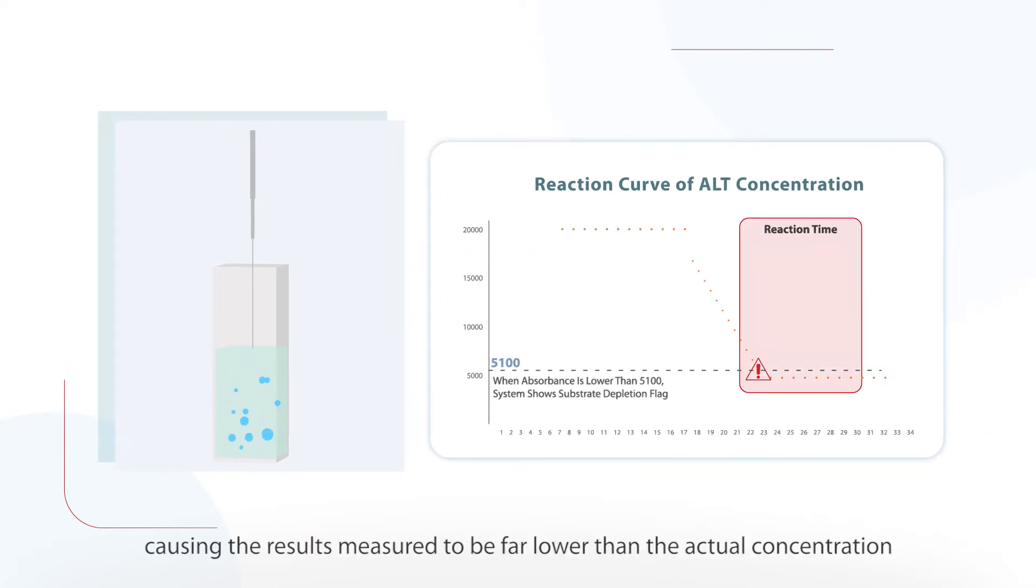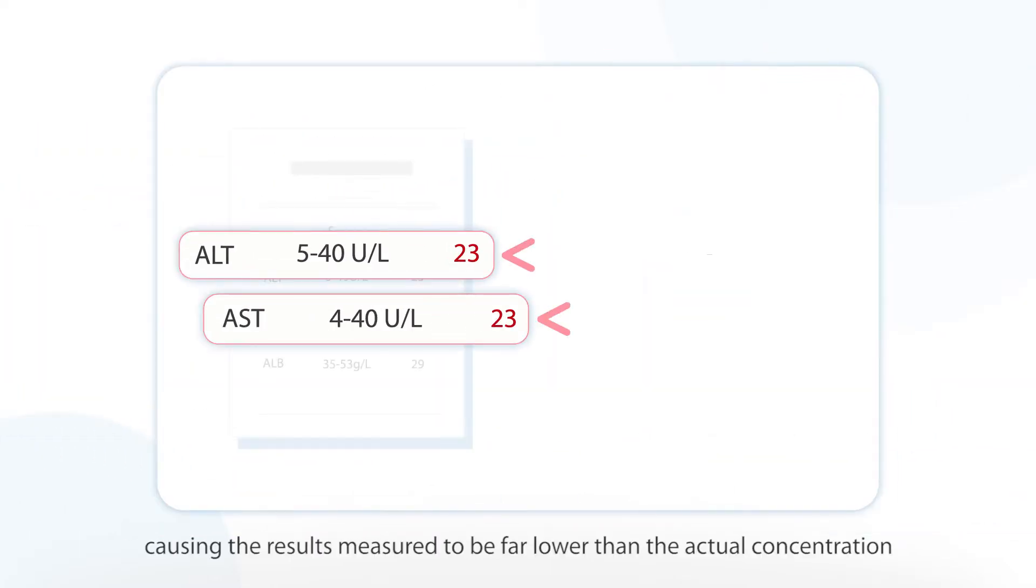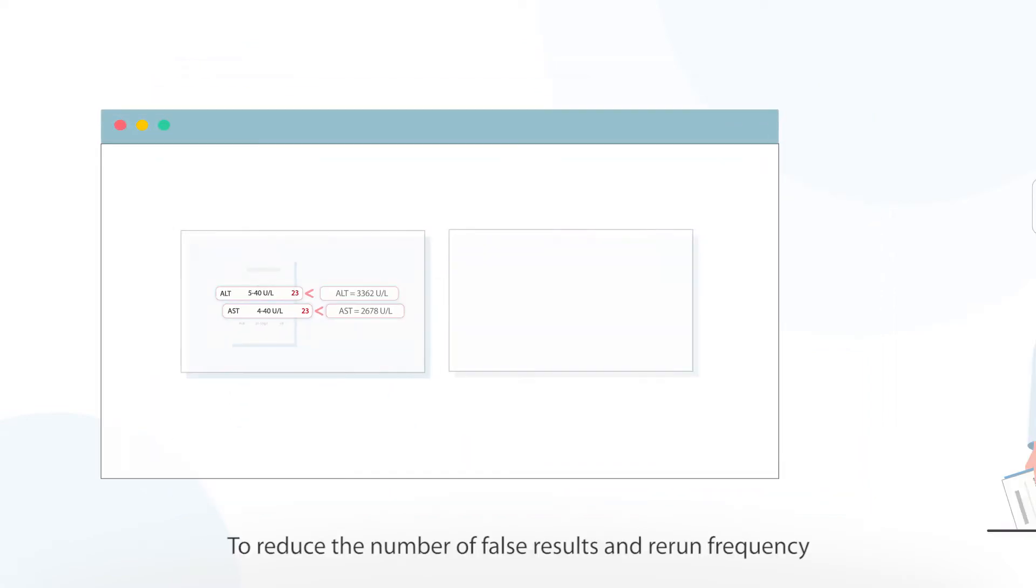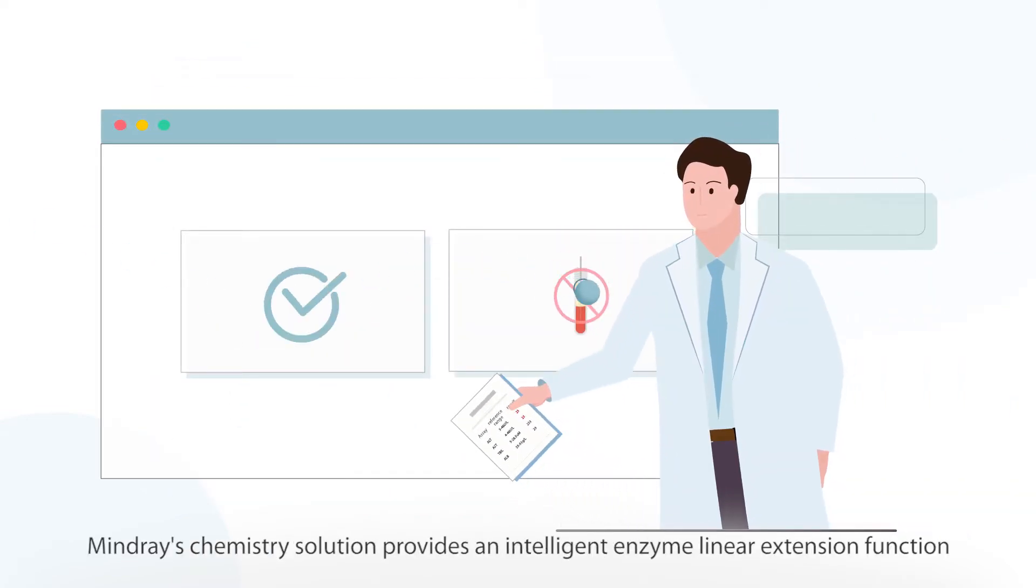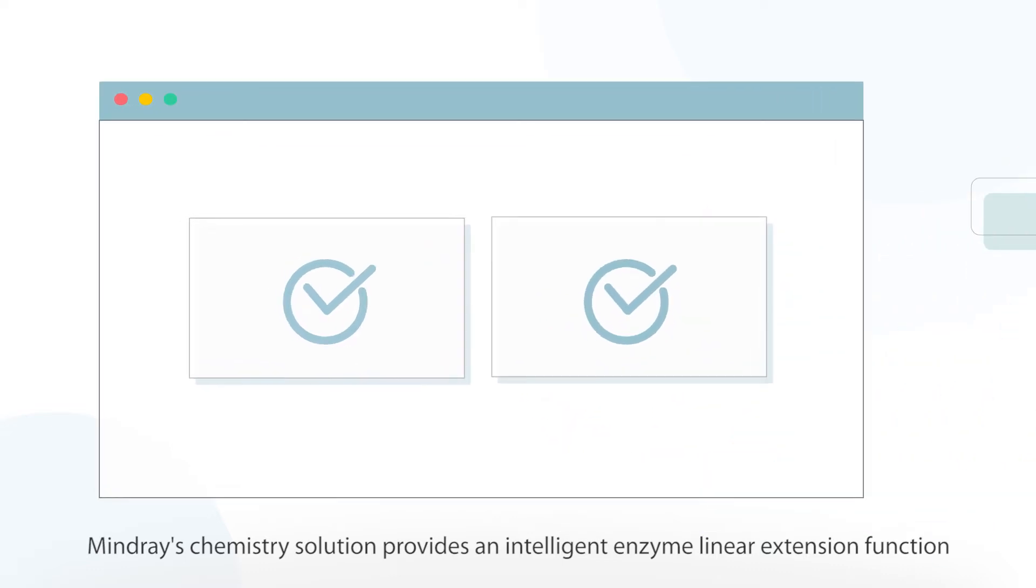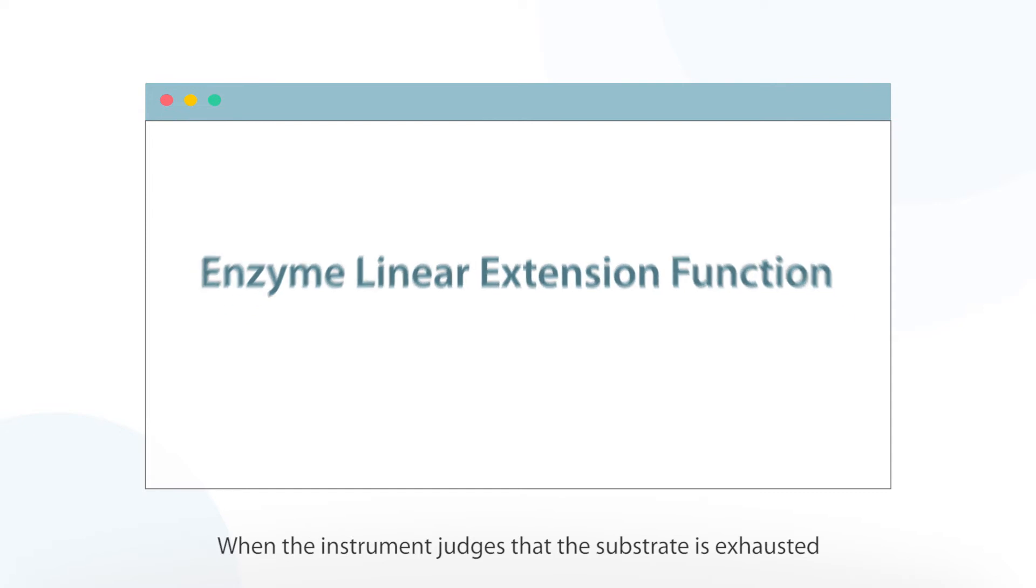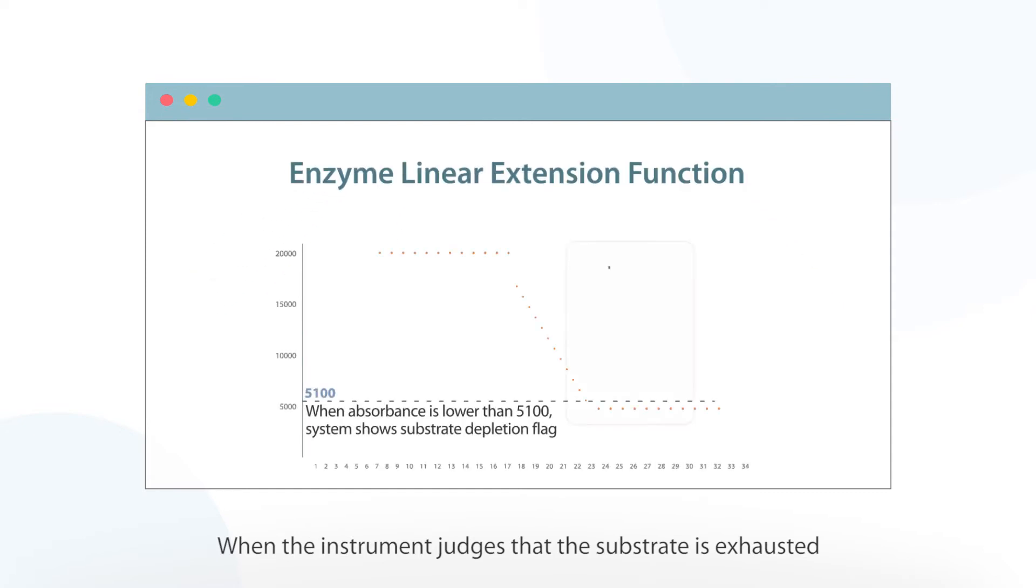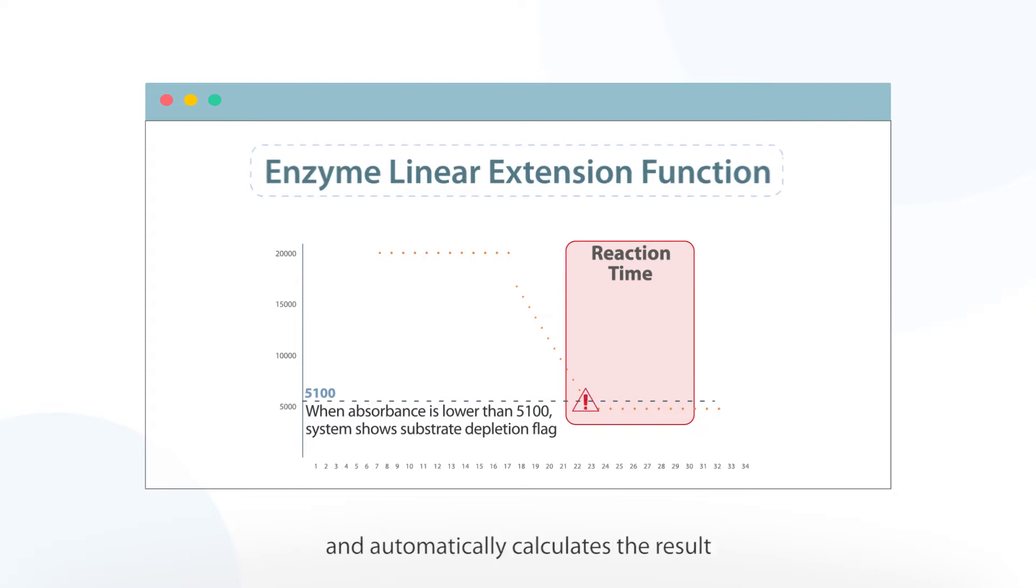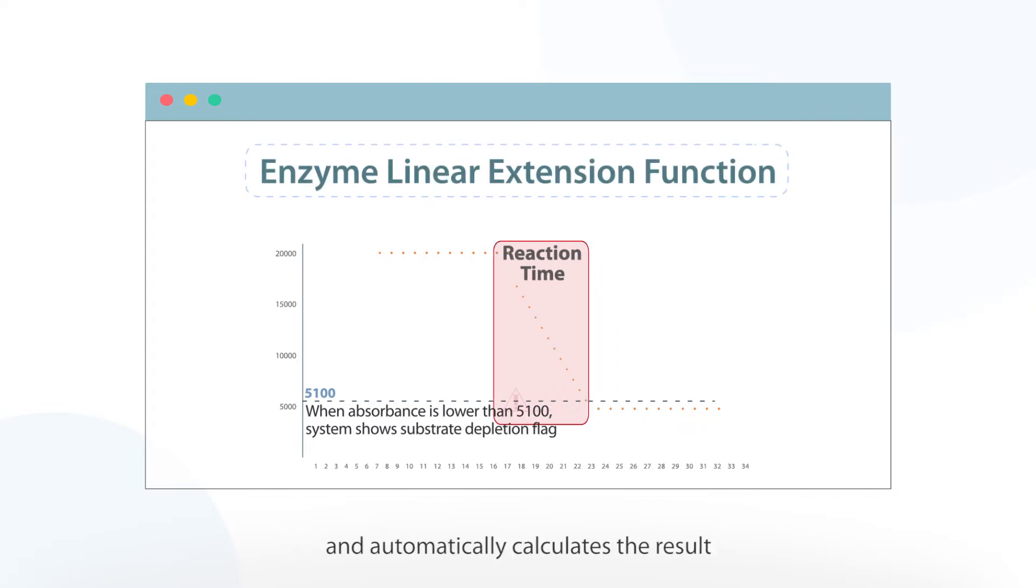This causes the results measured to be far lower than the actual concentration. To reduce the number of false results and rerun frequency, MindRay's chemistry solution provides an intelligent enzyme linear extension function. When the instrument judges that the substrate is exhausted, it starts the enzyme linear extension function and automatically calculates the result using the absorbance point in the linear change.